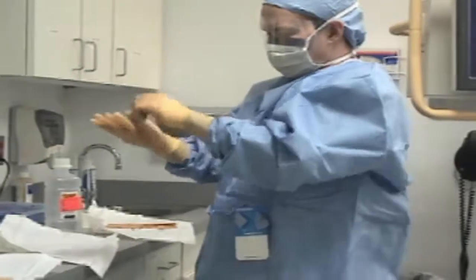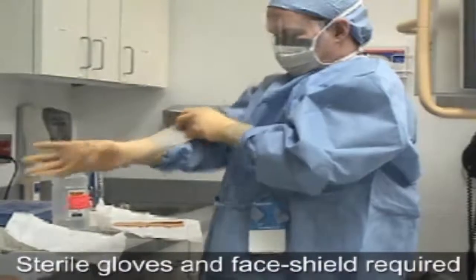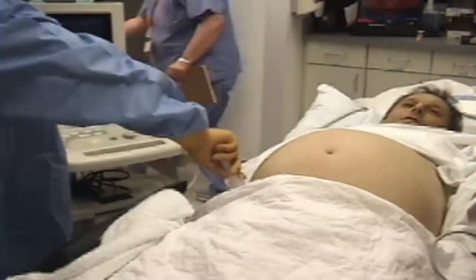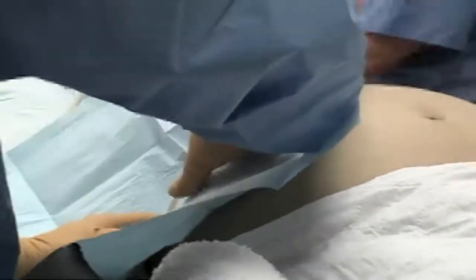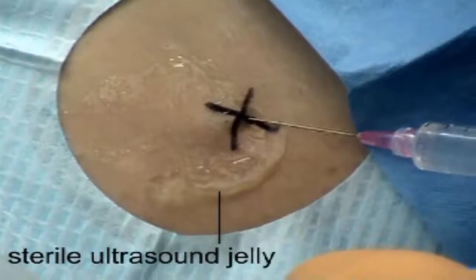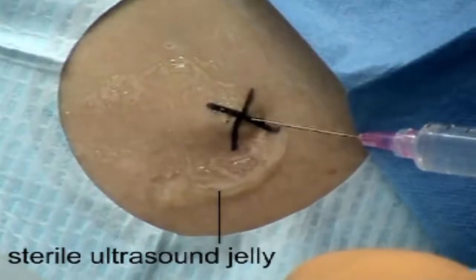Paracentesis is a sterile procedure. Sterile gloves and a face shield are required. The use of a sterile gown is optional. Prepare the site with an antiseptic solution and then apply a sterile drape. Using a 22 or 25 gauge needle, anesthetize the superficial skin with a wheal of local anesthetic such as lidocaine.